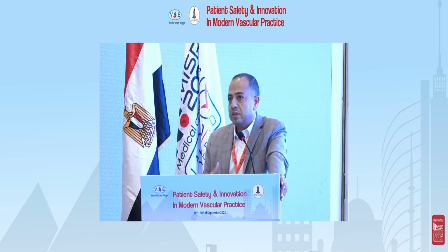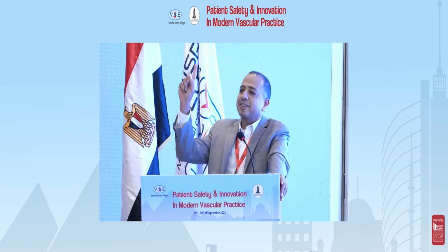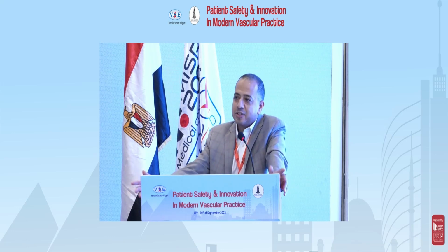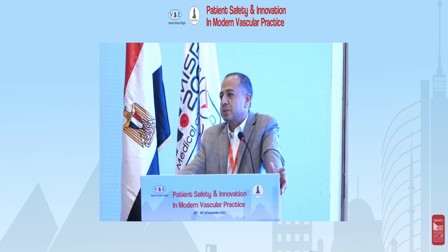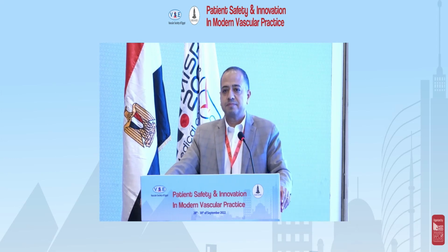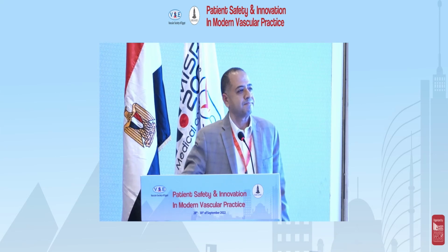So it gave me a lot of confidence to do it while I have the catheter pointing to the left renal artery. So maybe later I will use CO2 alone, but I think both of them together is very beneficial. Yes, thank you, Professor Ahmed.